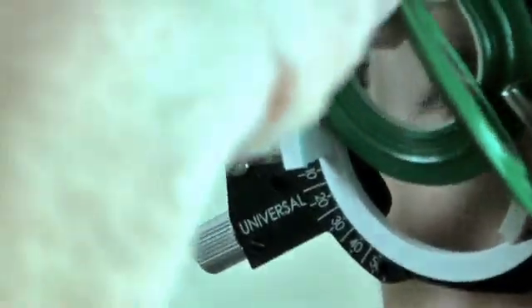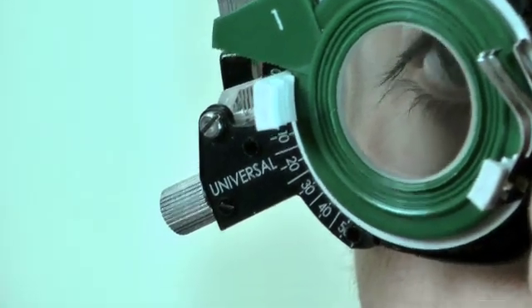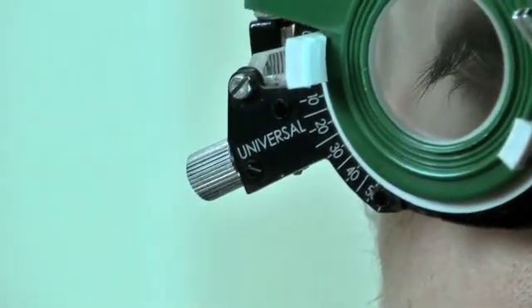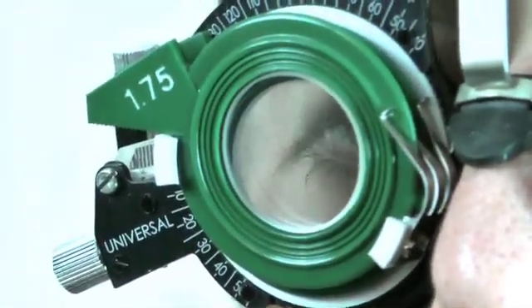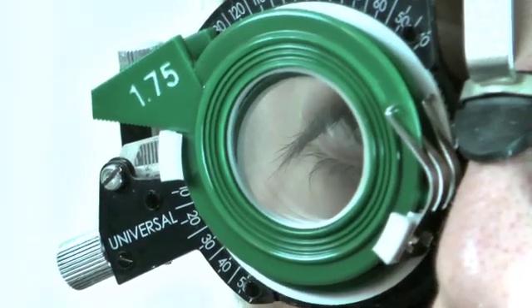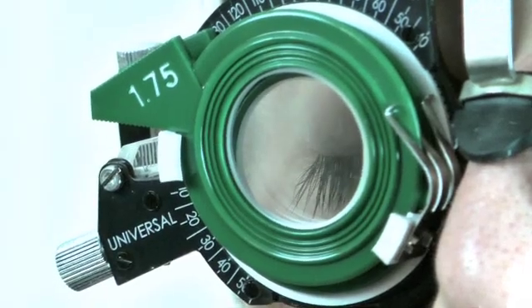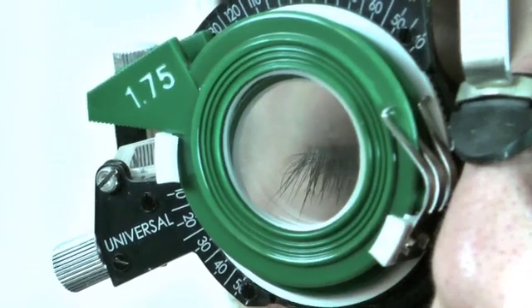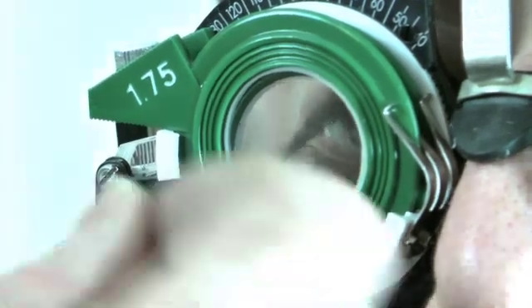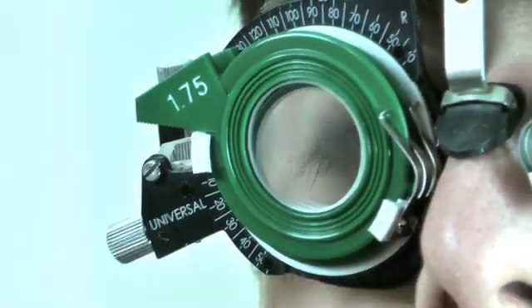It's important to leave that one in when you're doing this to make sure that their accommodation is relaxed. We put the 1.75 in, and we now have reached the best vision sphere for this patient, providing he says that is nice and clear or that gives them the best results on the chart. So we fine tune with just the very weak lens, that 0.25, and just double check before we make the final decisions.